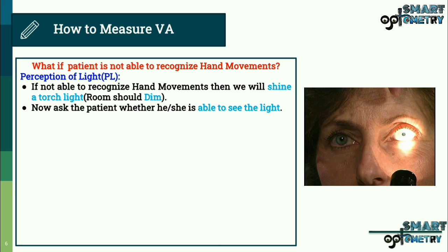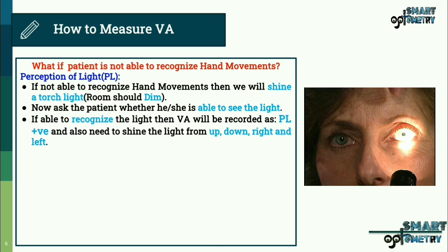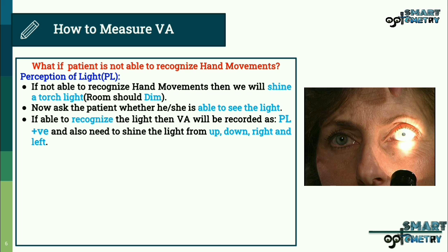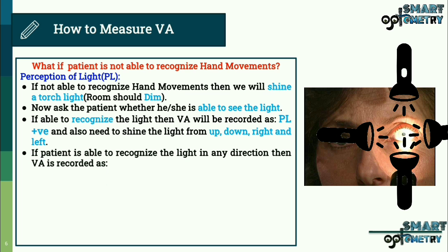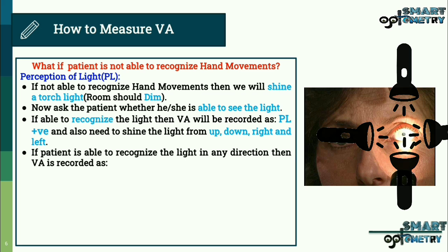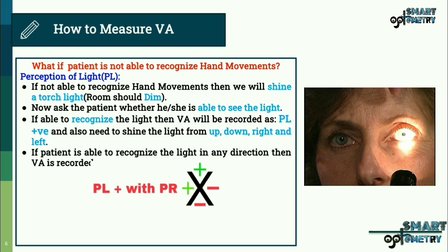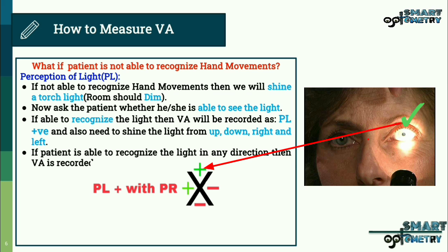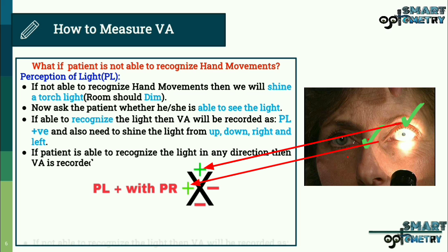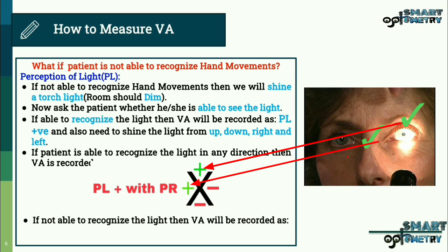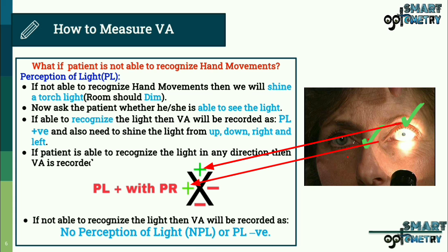Ask the patient whether they can see the light. If they can, visual acuity is recorded as PL positive, and we also shine the light from up, down, right, and left to identify the projection areas — recording as PL positive with PR (projection region) noting which directions the patient can appreciate the light. For example, if the patient appreciates light in the upward gaze and nasal side, those directions are recorded as positive and the others as negative. If the patient cannot recognize the light at all, visual acuity is recorded as no perception of light (NPL) or PL negative.